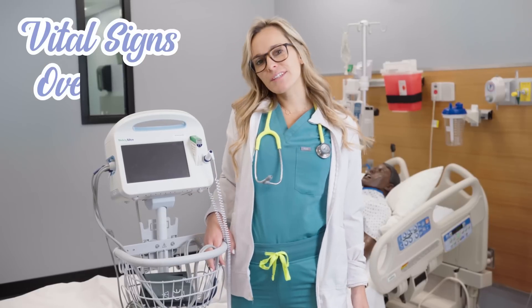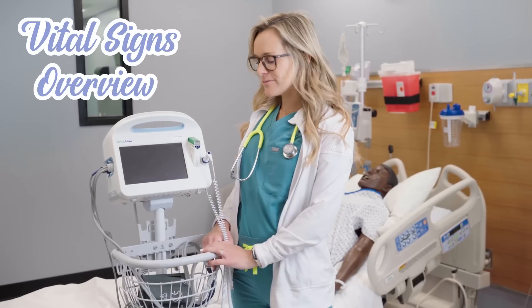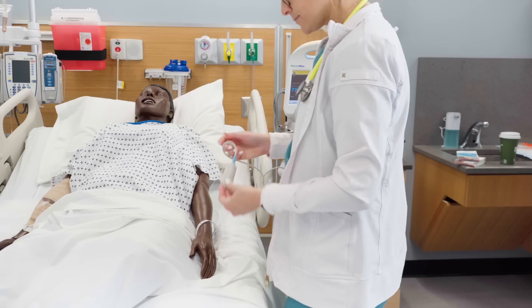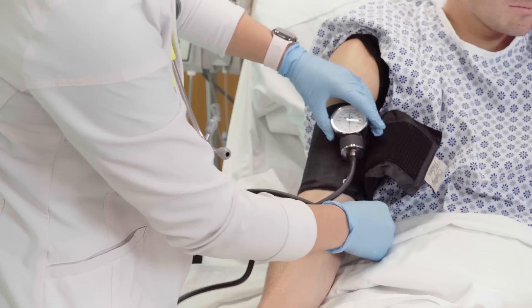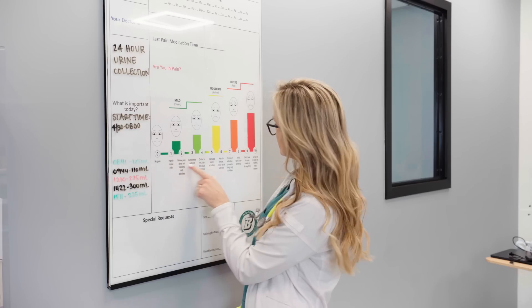Hey there, it's Christine from Nurse in the Making, and today we're going to talk about vital signs. We're going to look at how to obtain a pulse, an oxygen saturation, respiratory rate, blood pressure, temperature, and pain.